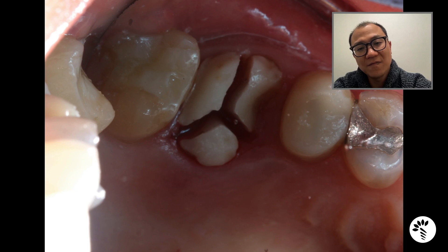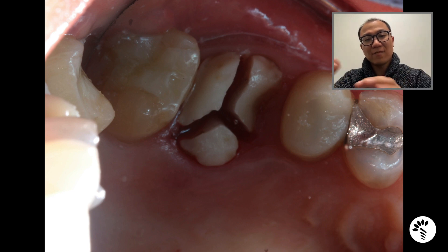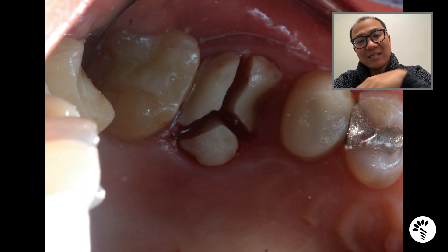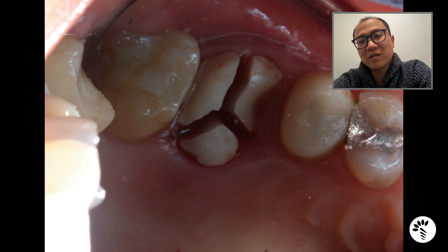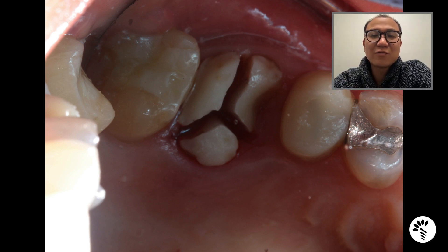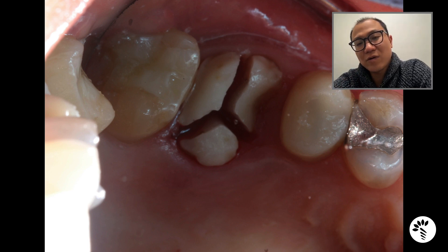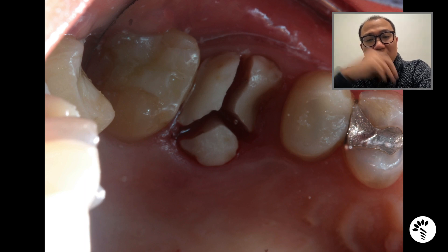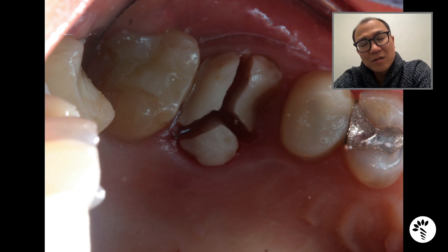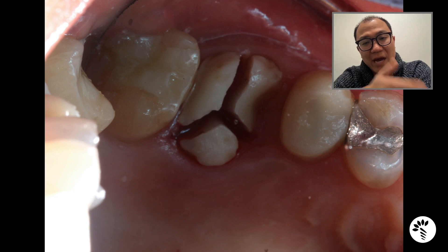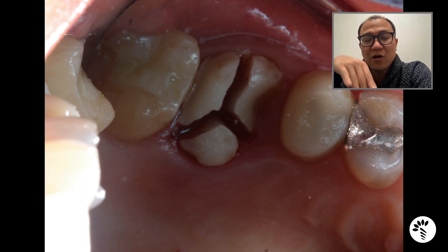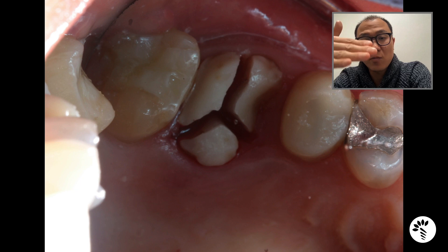Secondly, sectioning is also very useful when doing extraction around areas where adjacent teeth have large restorations or crowns. When you try to elevate a tooth with multiple long roots against a tooth with a large restoration, there is more chance that the extraction can lead to damage to the adjacent tooth's restoration or crown. When sectioning upper molars, always think about the Y-shape — you want to section through the furcations from the buccal furcation to the mesial palatal and distal palatal furcation.